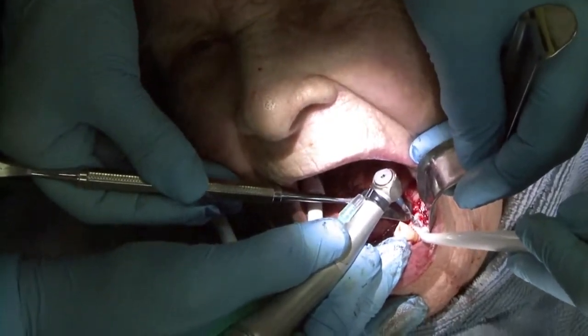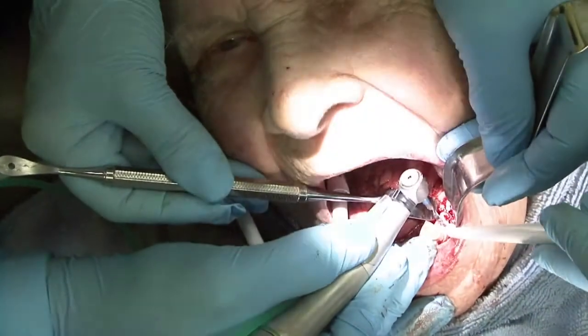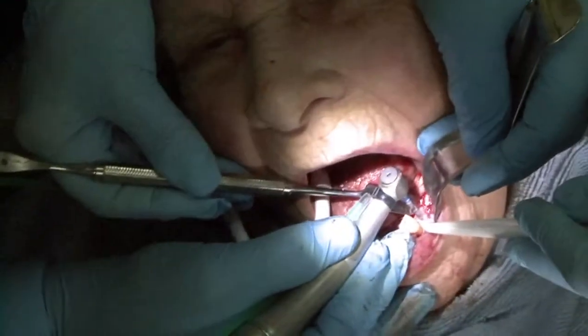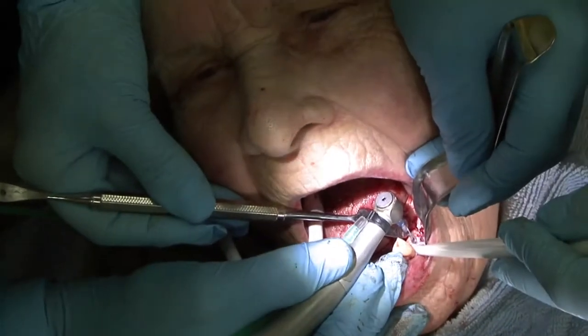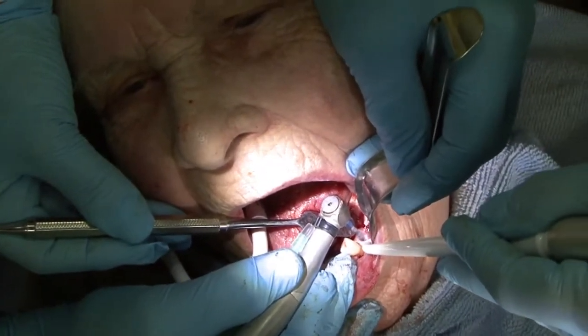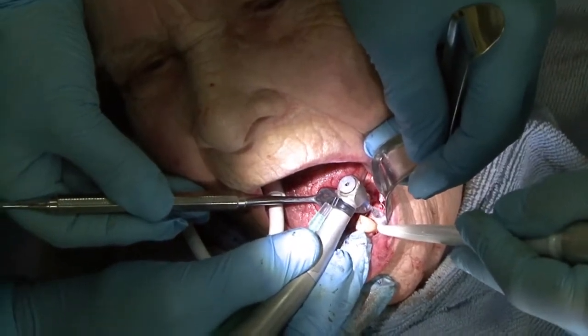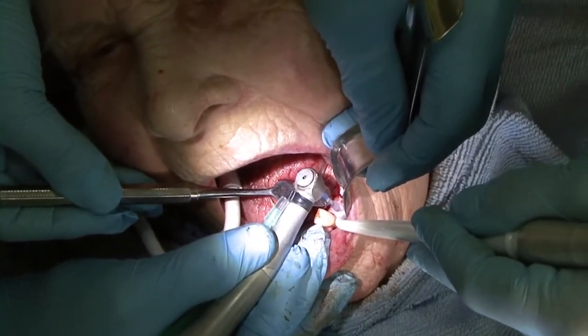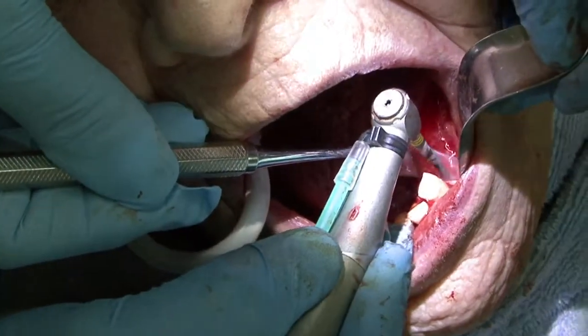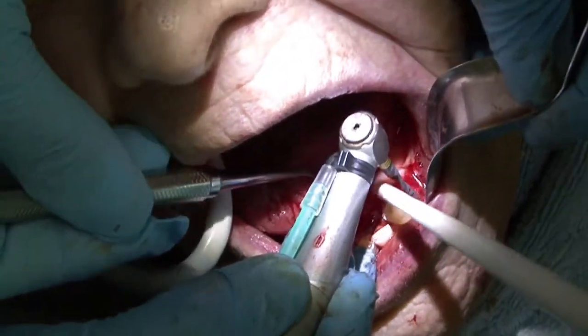How am I doing? You like my angle? I do, yeah. You sure I'm parallel? Uh-huh. Okay, yeah, from this point. Suction right on bone. Stay on bone, honey.